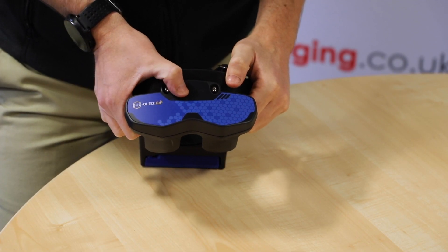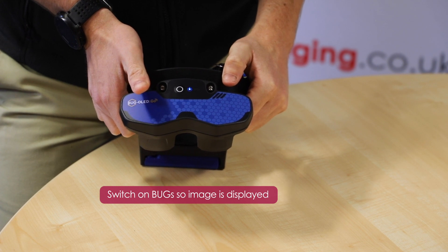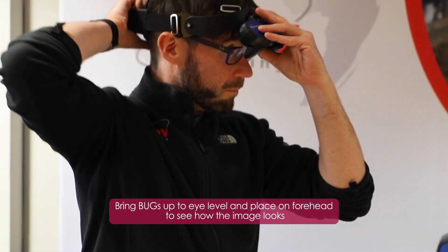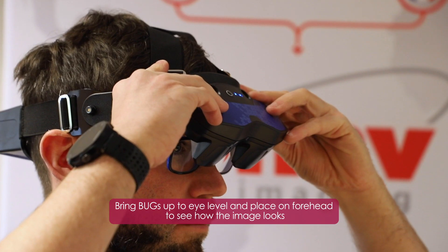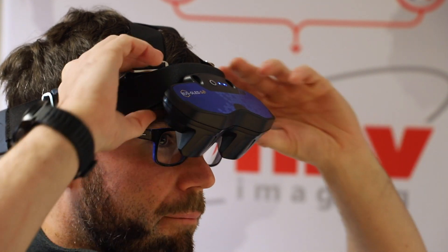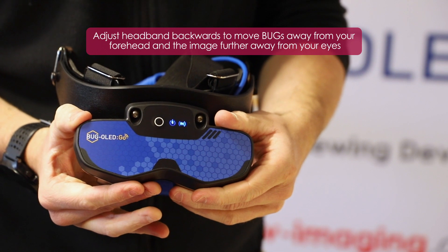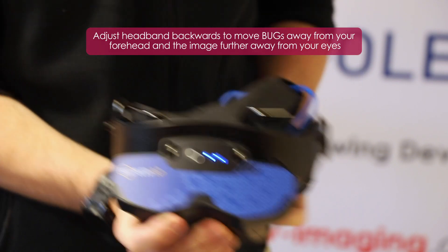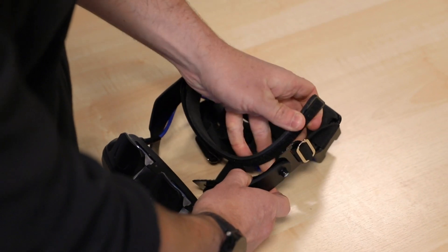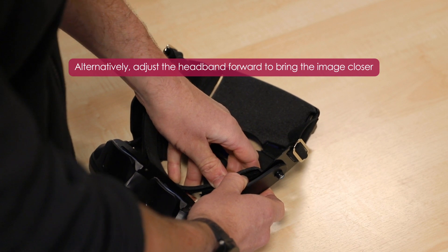The best way to do this is to switch the bugs on so that an image is displayed. Bring the bugs up to just above eye level as you would wear them when using them normally, placing your forehead on the headband to see how the image looks. From there you can bring the headband backwards to bring the image further away from your eyes and the bugs further away from your forehead, or alternatively bring the headband forwards to bring the image closer.